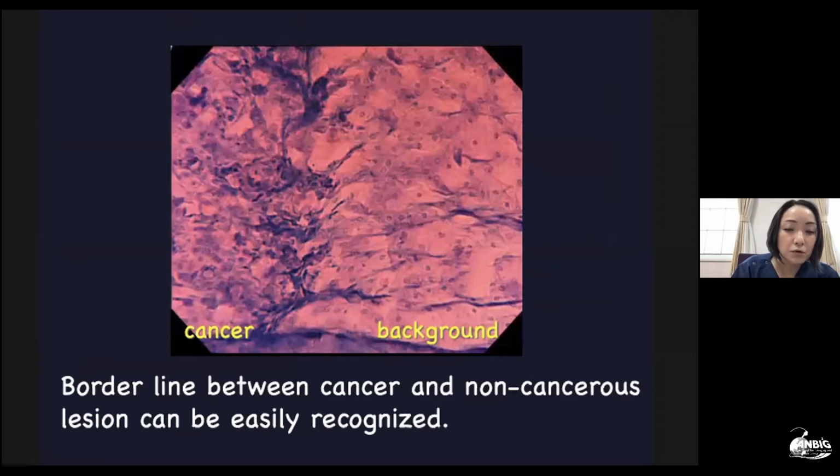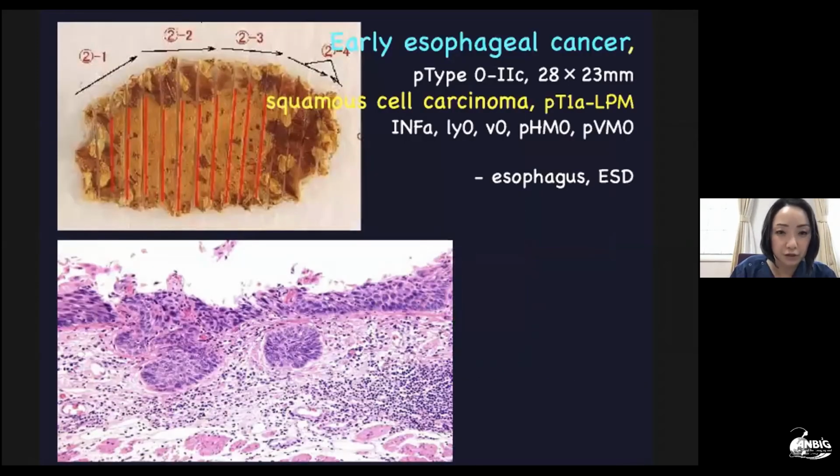And you may see the borderline between cancer and non-cancerous area very clearly. In the right part of the image is non-cancer, but in the middle there's a borderline, clearly recognized there. And in the left part, the nuclei are enlarged and the number is increased, so we can predict the lesion is a cancer. And we conducted ESD on this patient, and it was actually M2 cancer.